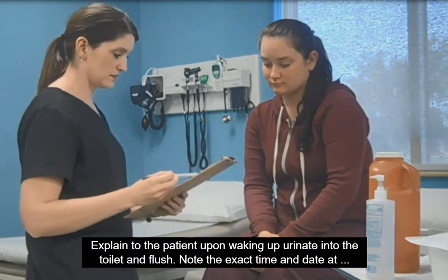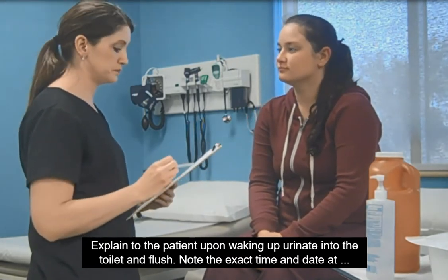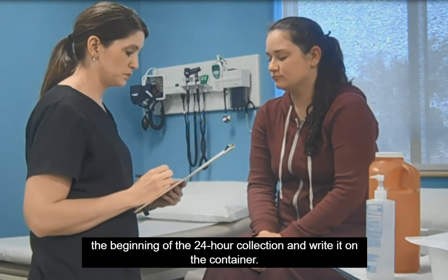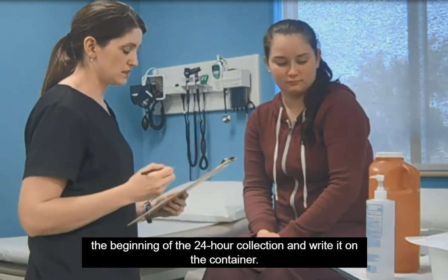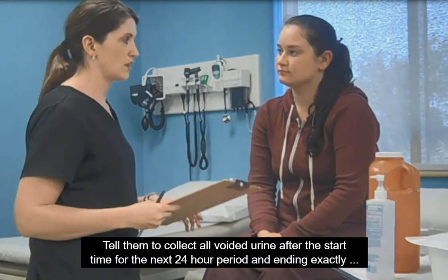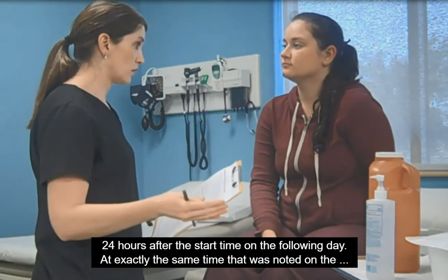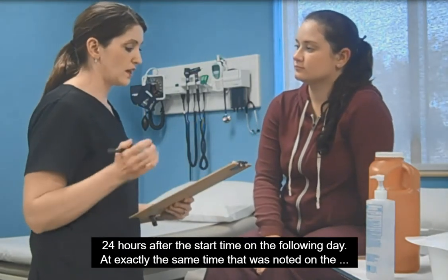Explain to the patient that upon waking up, they should urinate into the toilet and flush. Note the exact time and date at the beginning of the 24-hour collection and write it on the container. Tell them to collect all voided urine after the start time for the next 24-hour period, ending exactly 24 hours after the start time on the following day.